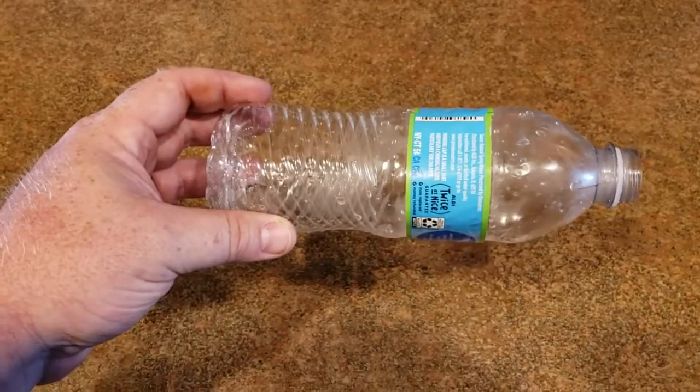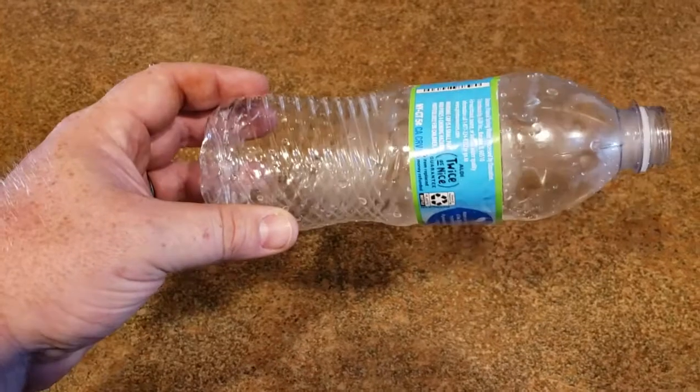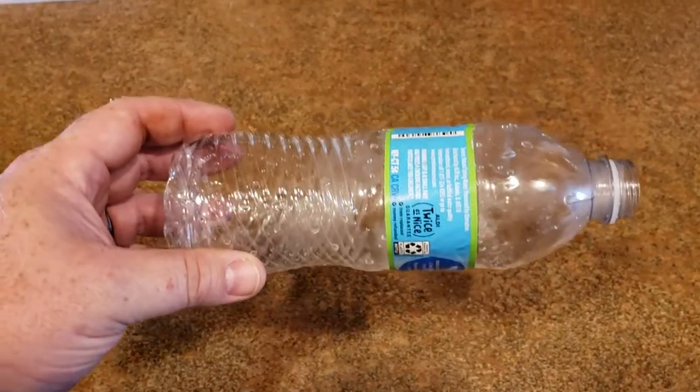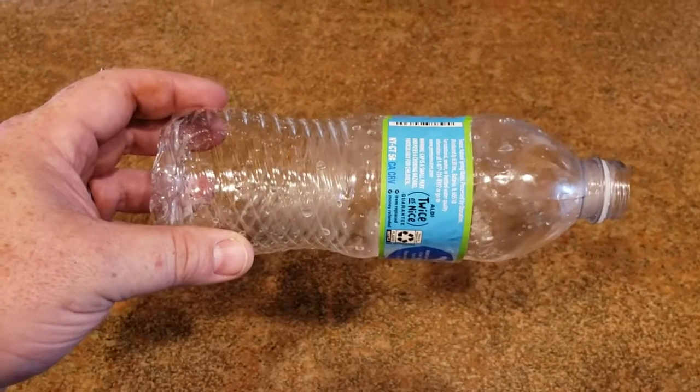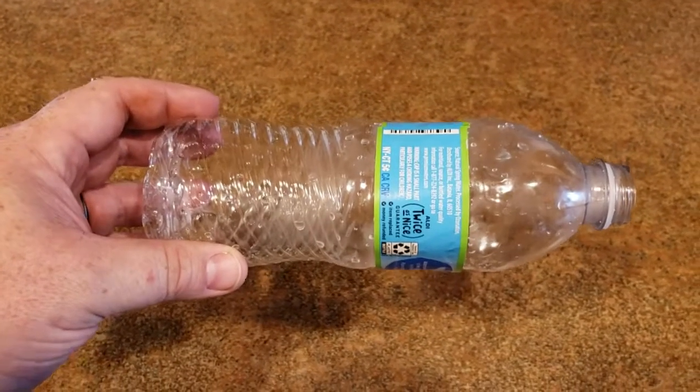Here's a video on how to make a homemade oxygen cone from a water bottle. You just want to find a standard appropriate water bottle that will fit the animal's snout or muzzle.